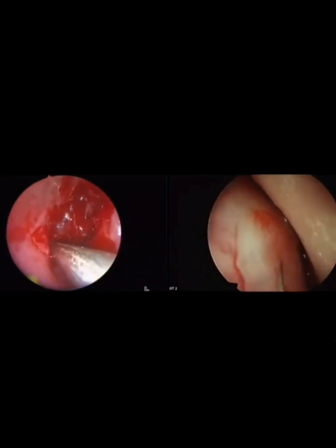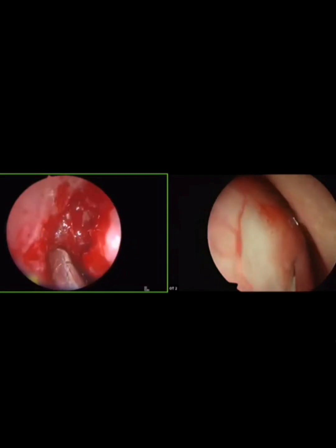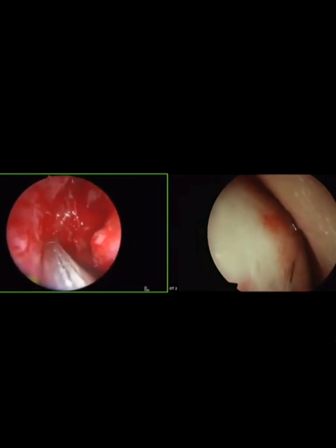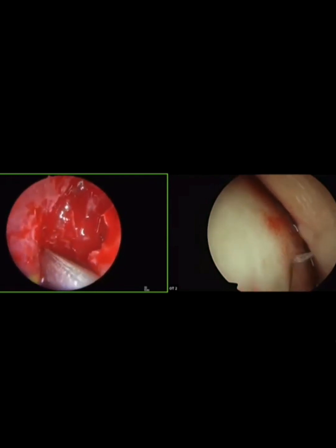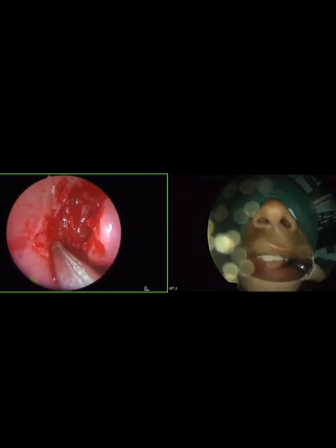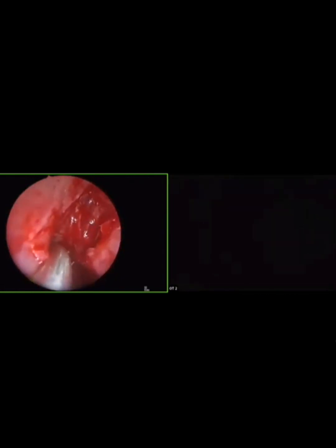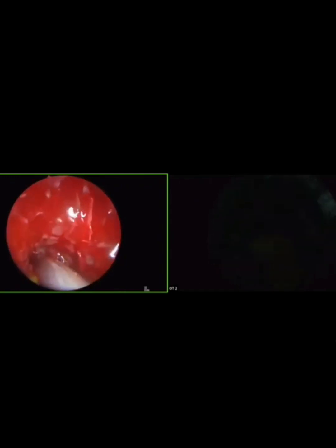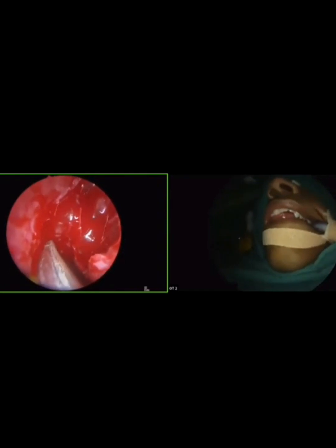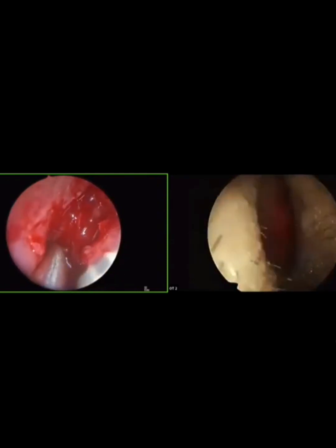Okay. And for inside frontal sinus, we can use 40, 60, 120 degree inside the maxillary sinus. Uncinectomy I had done only with debrider. This is the area of the maxillary sinus. For seeking the maxillary sinus, for entry, we have to push the suction laterally and inferiorly like this. For juniors particularly, laterally and inferiorly. If you hit like this, you may injure the inferior wall of the orbit. So this is the movement.